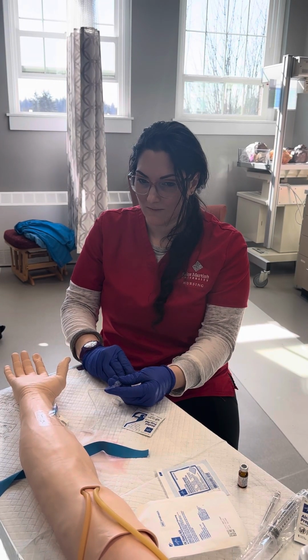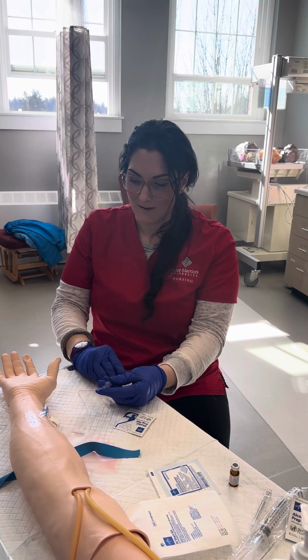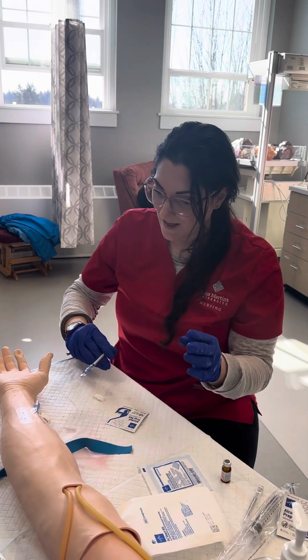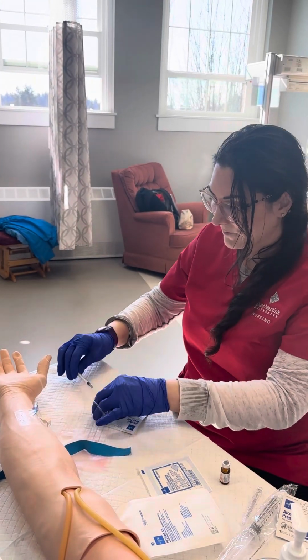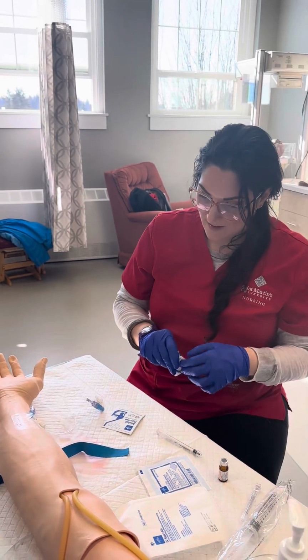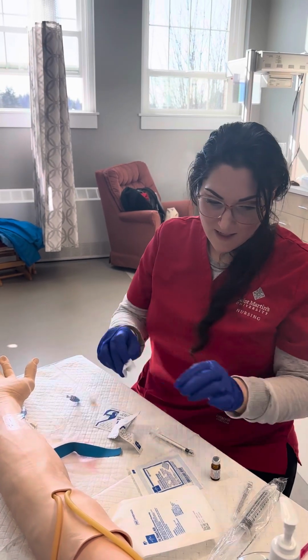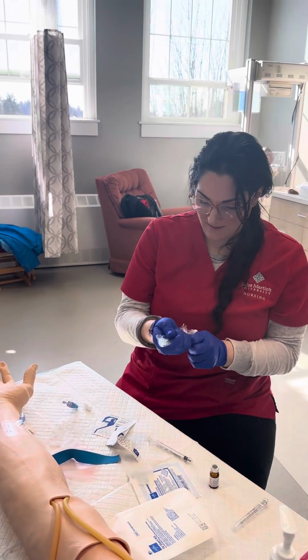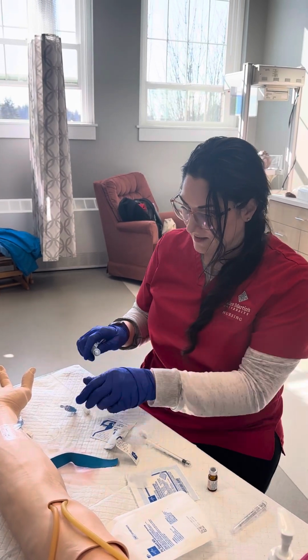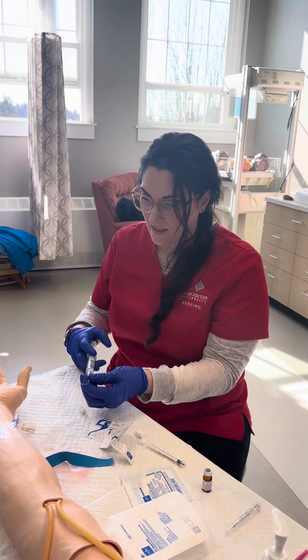After this, I am just pushing it. All right, 3 minutes I would have given that. I'm rushing it a little bit. There's that. Then I would clean this, and then I would flush it. I would be flushing this, I already cleaned this, for about 3 minutes after giving him his pain medication.